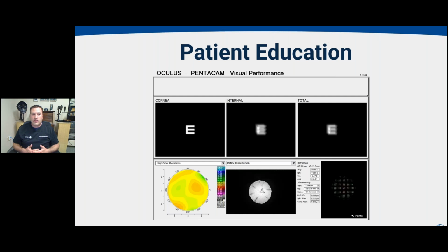And you can see it becomes very clear to a patient like this, as I explain to most patients in layman's terms. We generally use 3 parts of our eye to see. The cornea is that clear window in the front of the eye. Everything comes through that clear cornea, needs to go through your lens. Also, it lines up on one point on the macula and the fovea, and that's what we depend on to get clear vision. You can then clearly show a patient that your cornea, that clear window, is very clear, and you see with the simulation that you would see a very clear E with it. But internally, where your lens is located, that's where you're getting a lot of the blurriness of your vision. And you can certainly show them an OCT of their macula and say that looks normal.